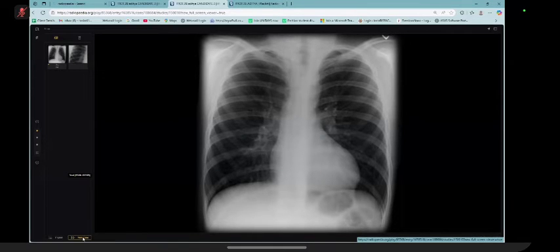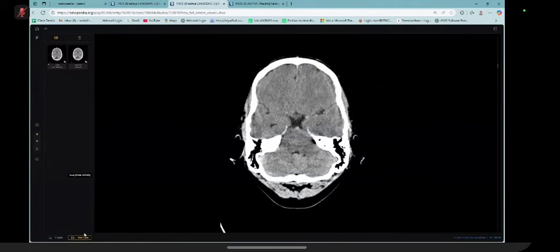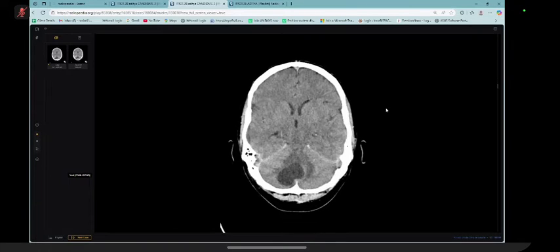Okay, now next is for you, and I will give you the clinical features for that. It's a 45-year-old male, and there are occipital headaches for this patient. Okay, and vomiting as well as dizziness. If you could take control and scroll it.